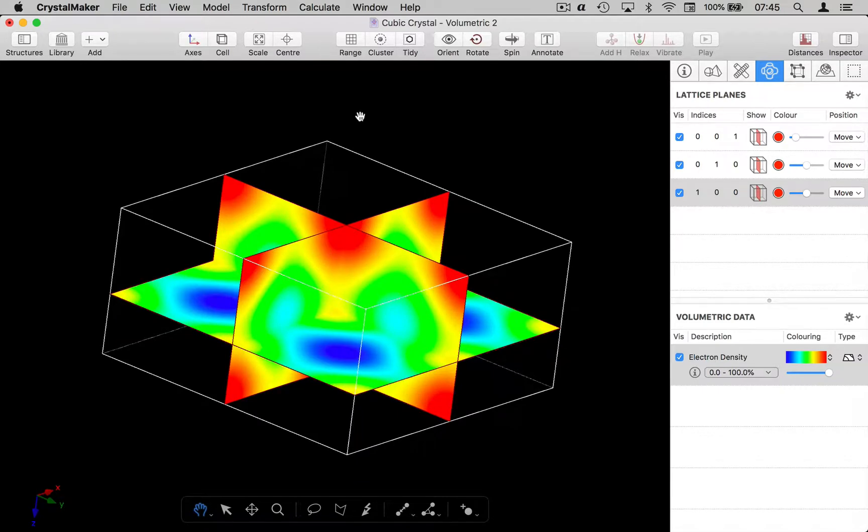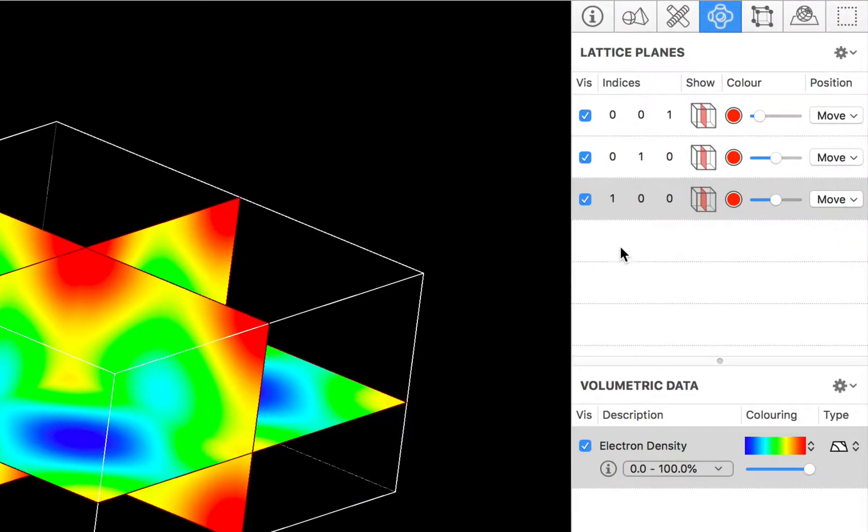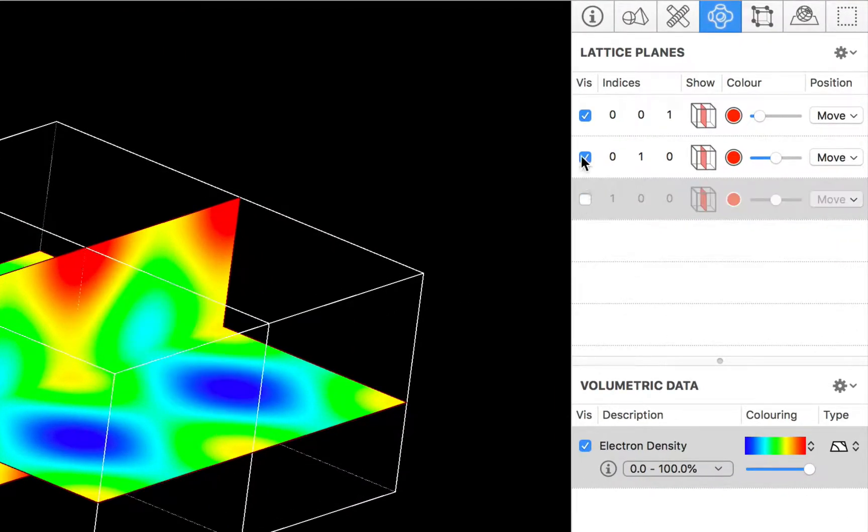Now we can change the way in which our volumetric data are displayed by using the controls in the volumetric data group. So let's just tidy things up for a moment and we're going to hide these three lattice planes.